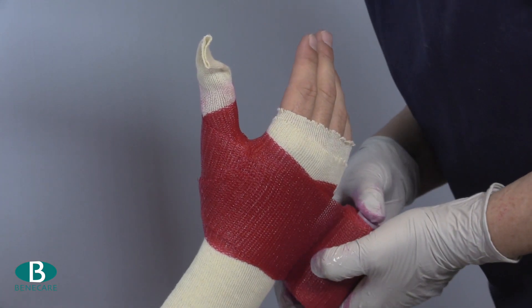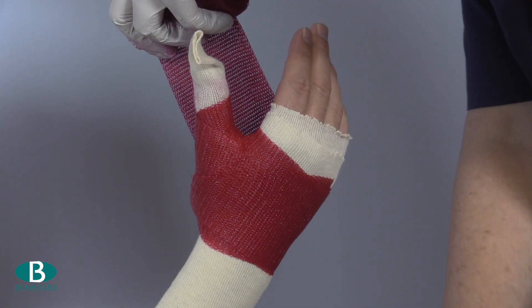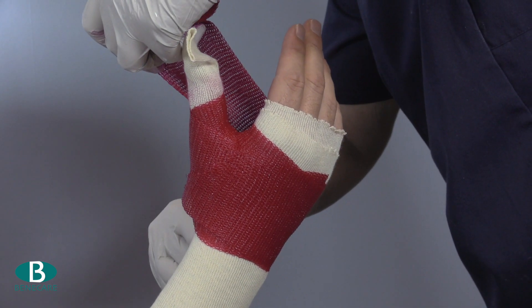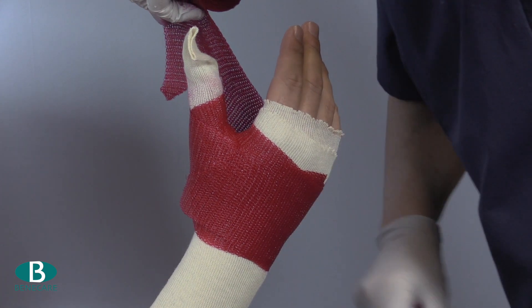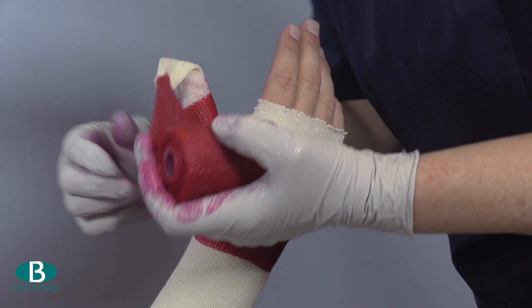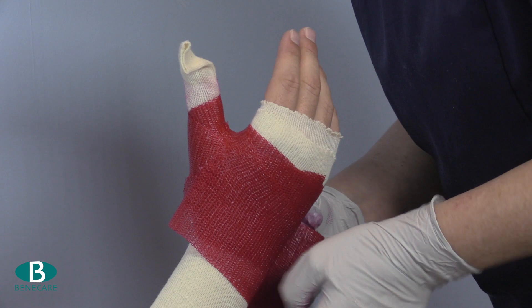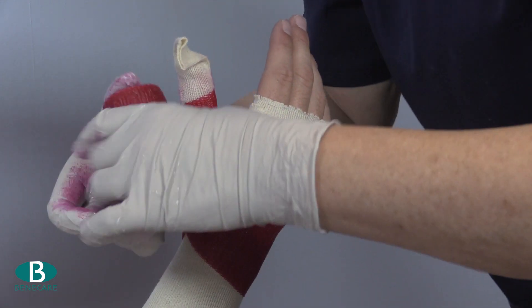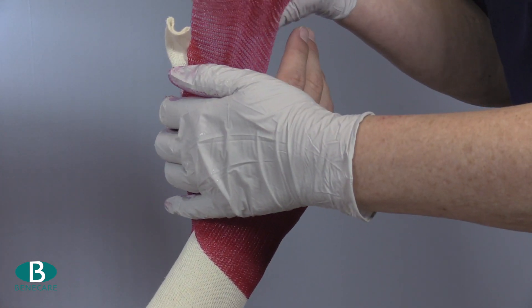Repeat this process once more, cutting the material to fit into the web space, then continue across the dorsal of the hand and once more directly around the thumb, capturing all ends in. A small cut may be required dependent on the size of the thumb.